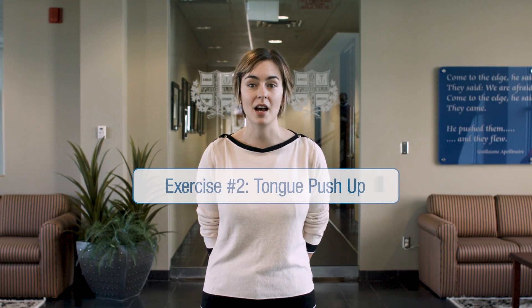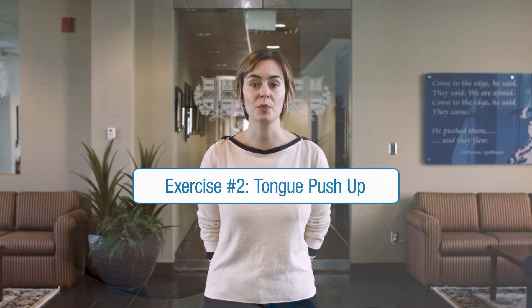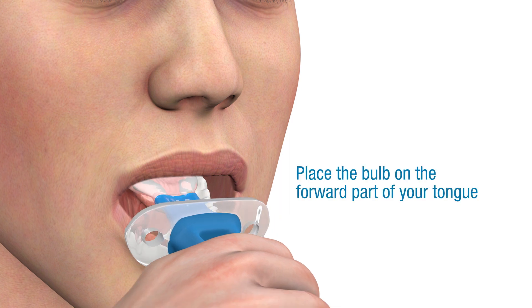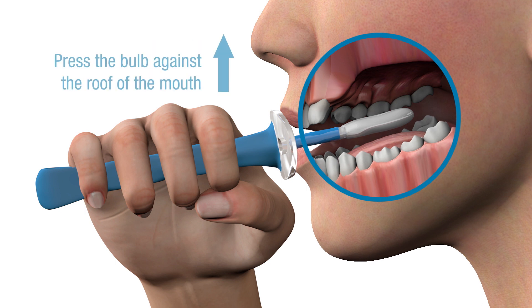The tongue push-up is designed to strengthen your tongue and work dorsal elevation. Start the push-up by placing the bulb on the forward part of your tongue. While keeping the handle of the Ablex device horizontal and using only your tongue, press the bulb against the roof of your mouth.